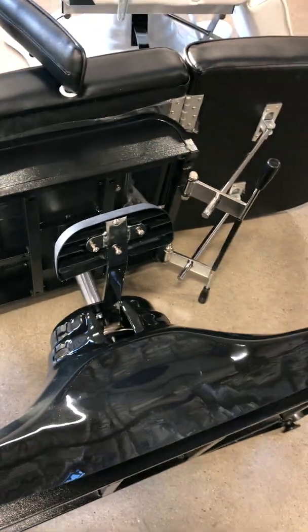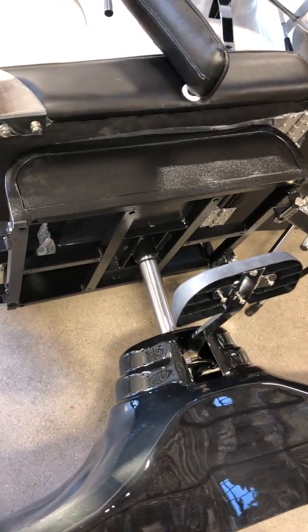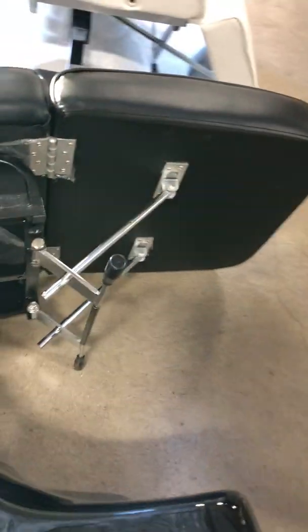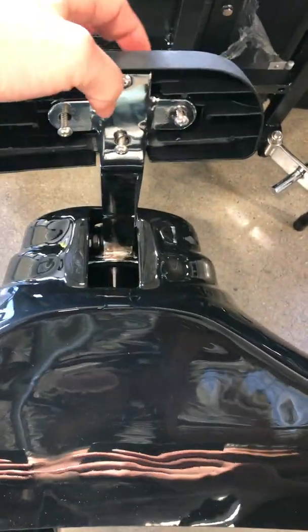Before you put it on the sideway, you just wanna make sure the height of the bed is all the way at the highest level, and also the footrest is all the way up as well. And now what we're gonna do is go ahead and open up all these 4 screws to remove the plastic cover from the pedal.